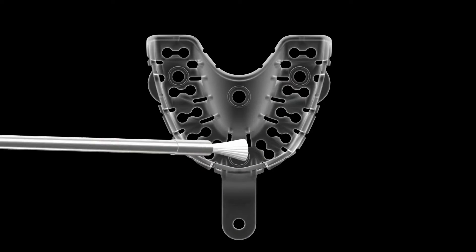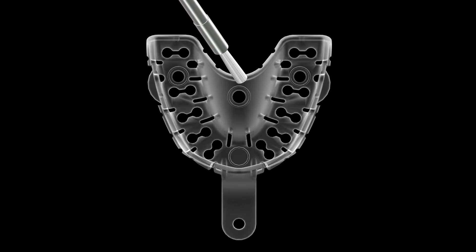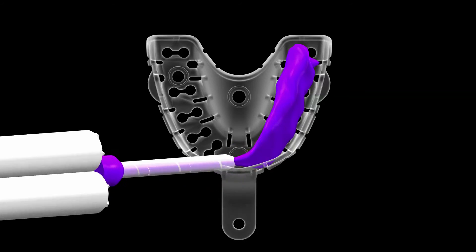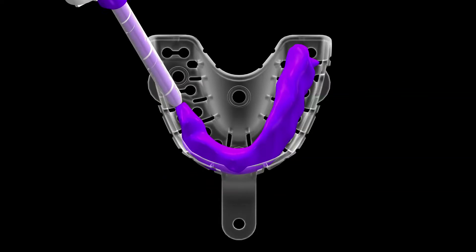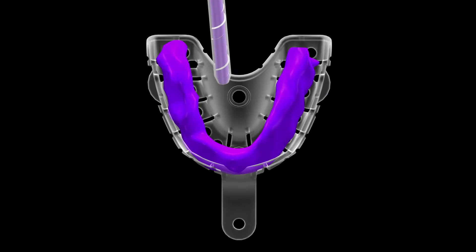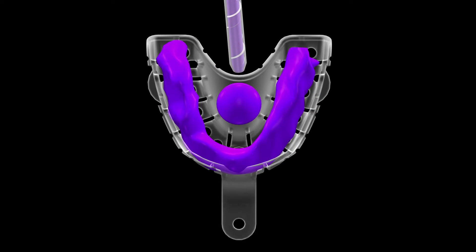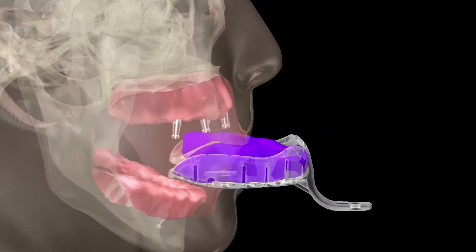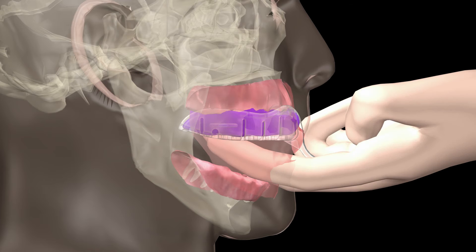Place PVS adhesive, followed by injecting a ribbon of extra-fast rigid PVS material into the tray, allowing more material in the area of edentialism and a much smaller amount opposite the implant copings and the palate. Place back into the mouth carefully centering the tray.